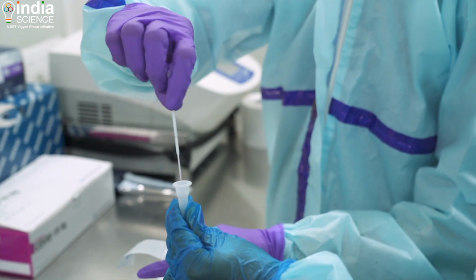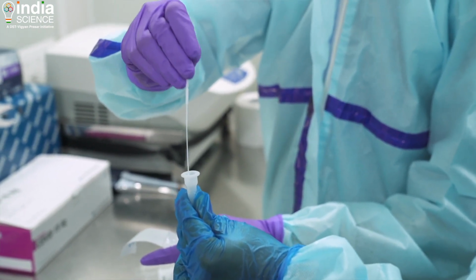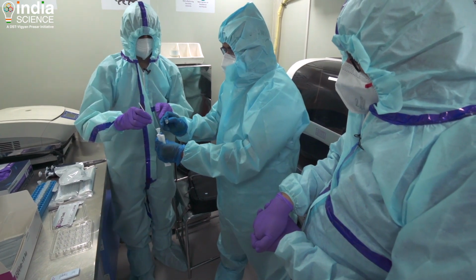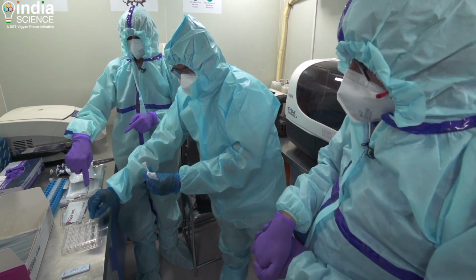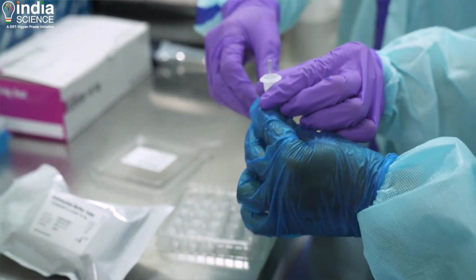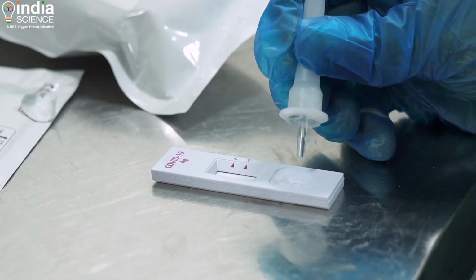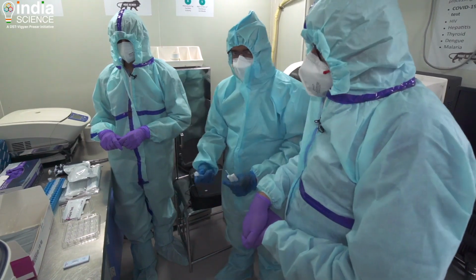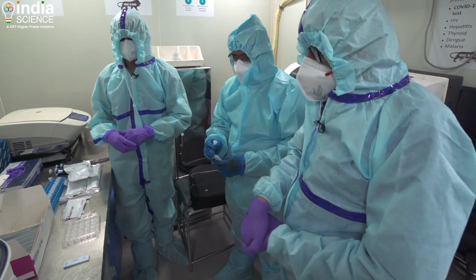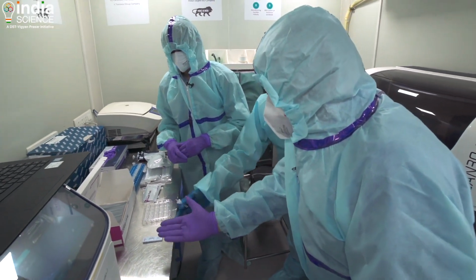You mix it very well. You can remove it or you can cut it off, and then this goes inside, and then you fit in a nozzle, and then you add a drop of your sample into that area. That's it. Wow. So much easier than RT-PCR. Of course, yes. And then it will show us positive or negative depending on what is the condition.